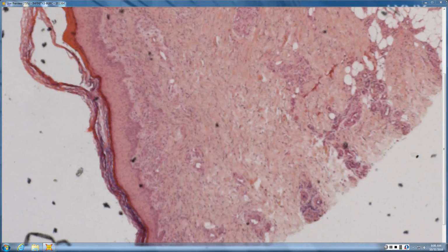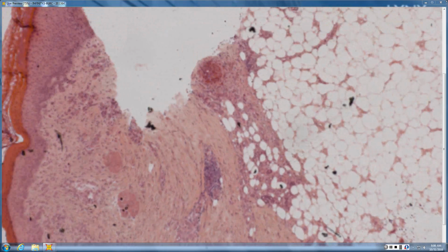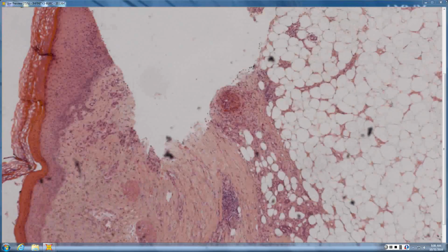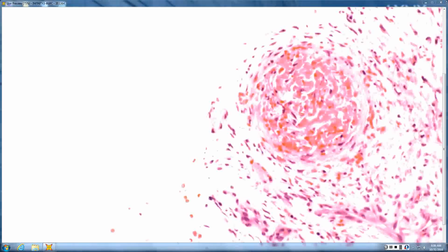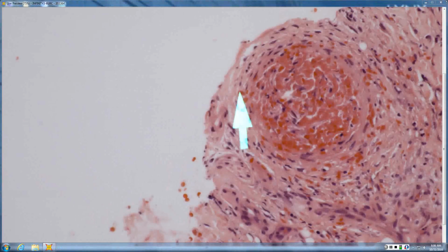Okay, and then what is happening in the dermis of this week or two old lesion? It looks like superficial and deep perivascular and perineural infiltrate. On the deeper vessel, it looks like there's some fibrin. Yeah, fibrin plugging, more probably a medium-sized vessel. So first off, it's very, very round, like an arteriole, right?